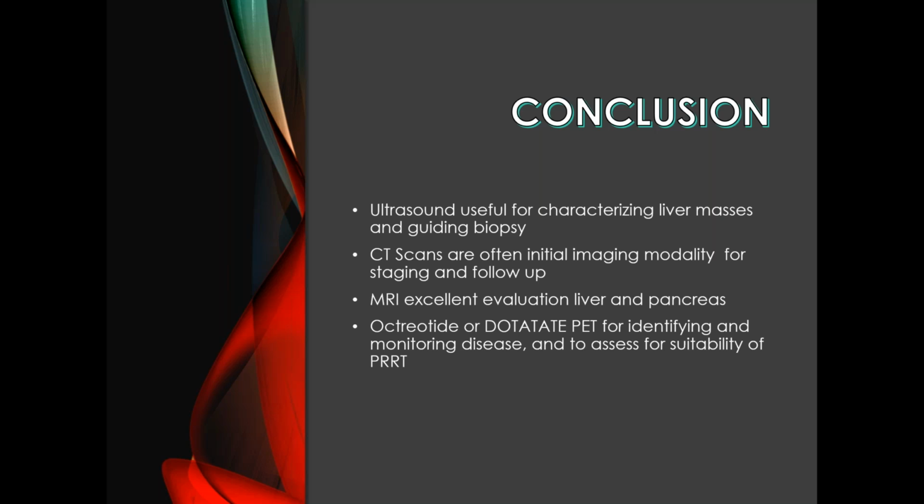3 mm is quite small, so I would have hoped that DOTATATE would have picked it up, but it doesn't sound like it did. Sometimes F18 DOPA might be able to find the tumor in the terminal ileum region. It might be helpful, so maybe an F18 DOPA could be useful. The other thing is it just may be so small that it's below any imaging modality's ability to pick it up.